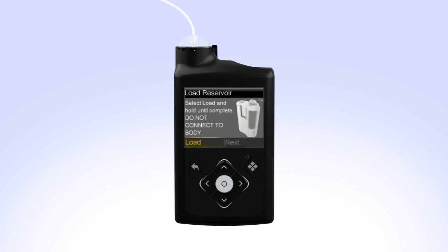With Load highlighted, press and keep holding Select until the screen shows Complete. When you see Complete, do not connect to body, and a yellow check mark on the screen — select Next.